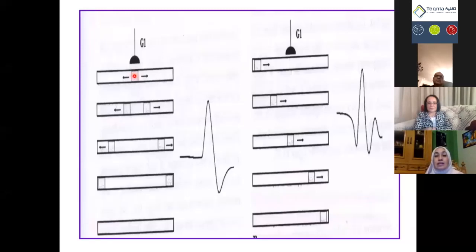As we all know, there is resting membrane potential in which the inside of the cell is relatively negative in relation to the outside. With depolarization, the inside of the cell becomes relatively positive in relation to the extracellular fluid. In another way, the extracellular fluid is relatively negative in relation to the intracellular fluid, and the needle electrode will record this negativity. In electrophysiology, negative potentials mean upward deflection, and positive potentials mean downward deflection. Upward deflections mean negative potentiality in the extracellular space. Okay?